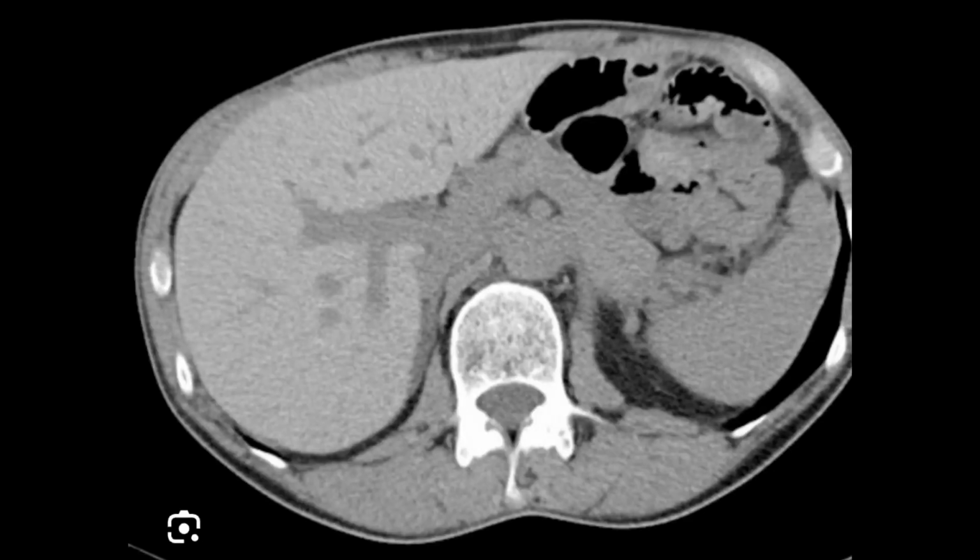For the confirmation of hemochromatosis and hemosiderosis, a variety of radiological imaging modalities are available. The first and the topmost is ultrasound imaging.